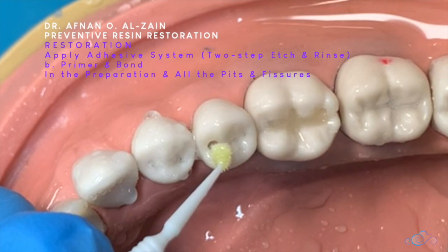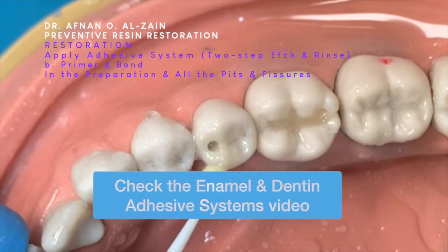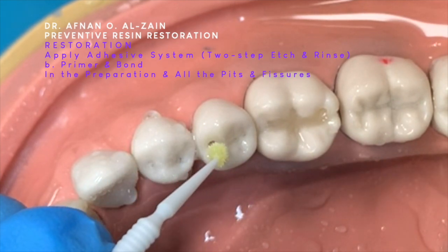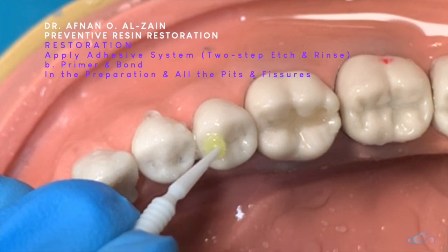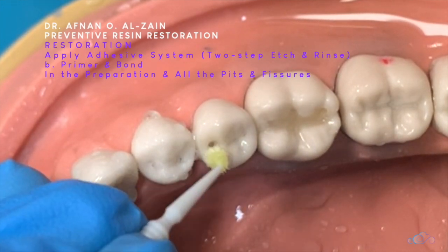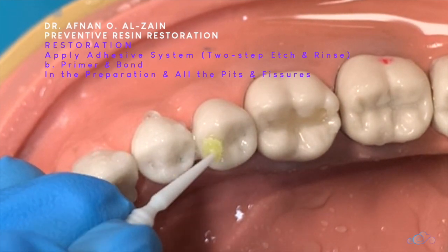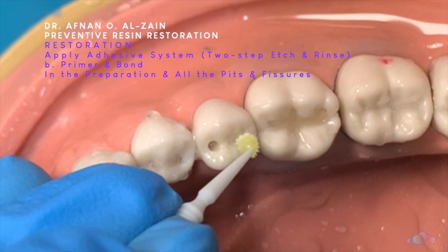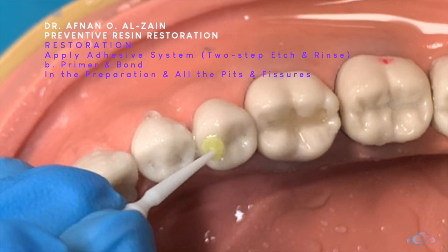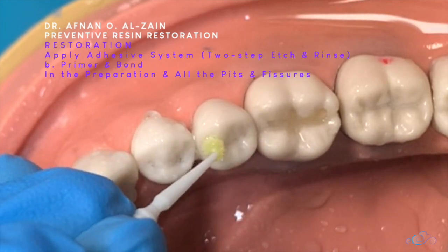We're going to apply the two-step bonding system. In this case, we have primer and bond in the same bottle. We apply it in the pit and all over. Depending on the fissure sealant, there are some two-step bonding systems, so it depends on the type. We're going to apply bonding on the surface.